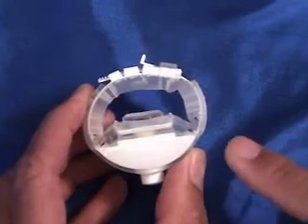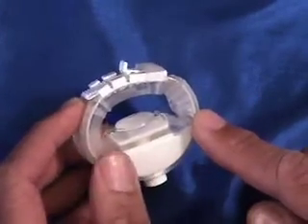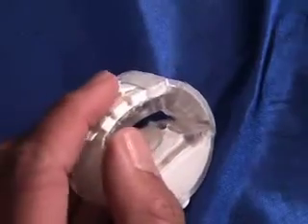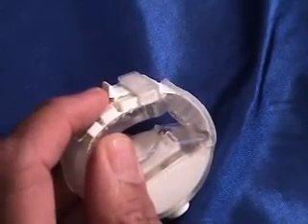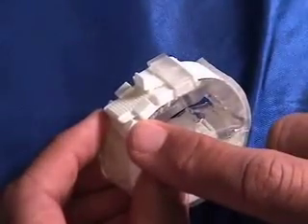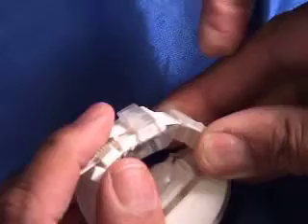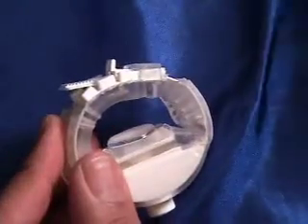It is not necessary to make the device very tight. Just gentle pressure is all that is required to prevent urinary leak. If the elevator mechanism is stretched, then the device may not lock securely. In this instance, the strap can be brought out through one of the ridges just before the last rail. This will effectively change the angle and allow the device to be locked securely.